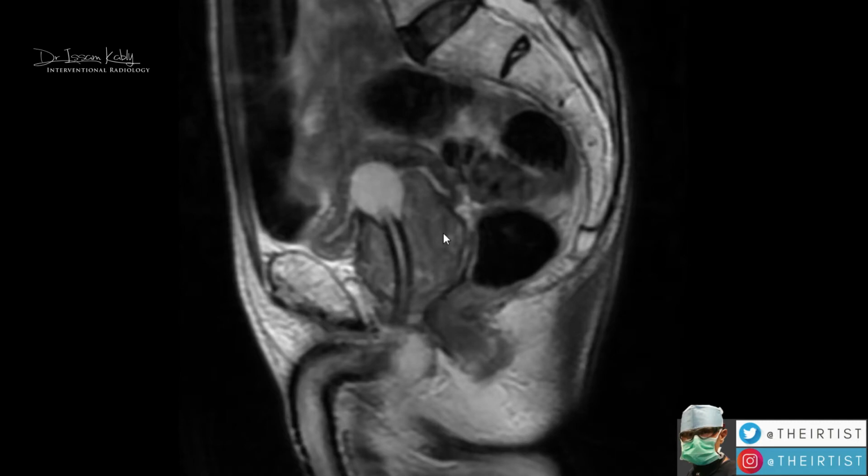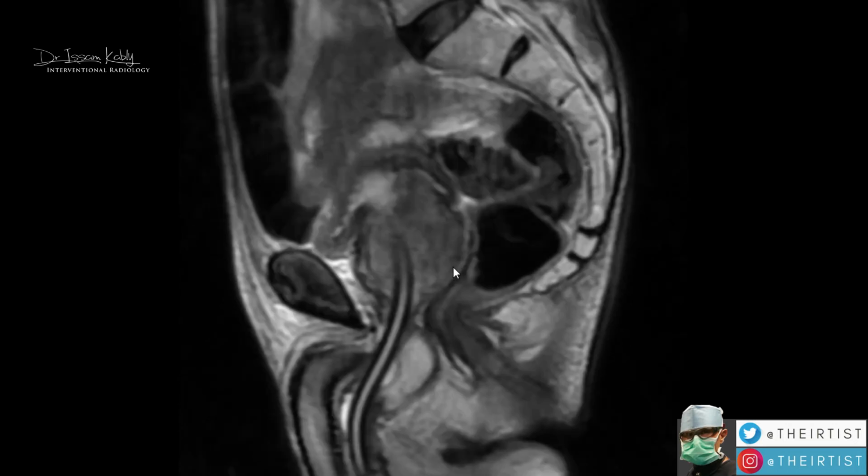But not only that, the PAE effect goes further to treat the underlying problem itself, which is the BPH and all the associated symptoms, and in this case, the complete urinary retention. So back to our prostate here as we scroll through.